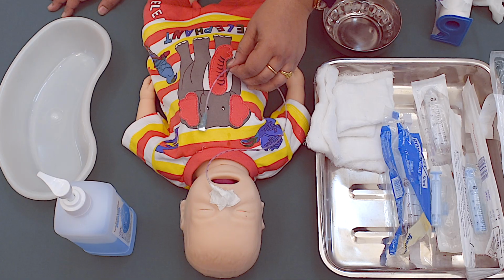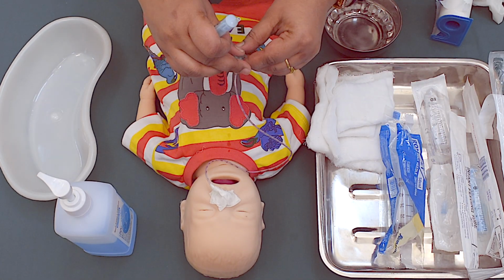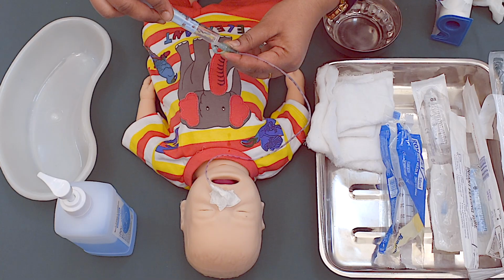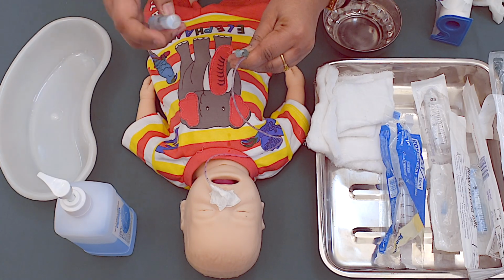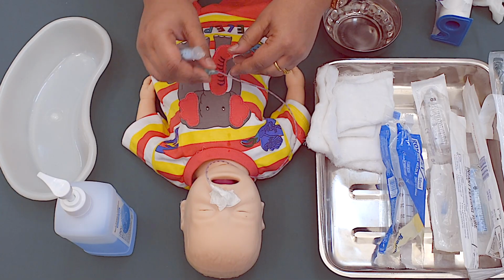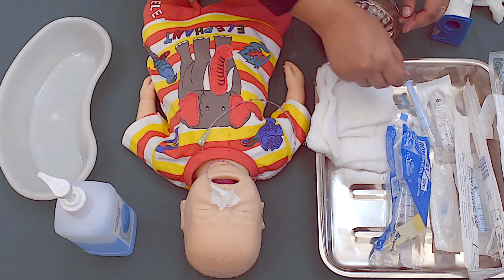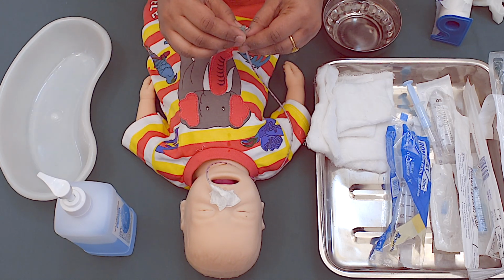Before we begin feeding the baby, check the placement of the tube by aspirating the contents. If we aspirate around 25% of the previous feed, the next feed has to be withheld. Notify the physician in case of abdominal distension or retention of the feed. In case there is no retention, the baby is now ready to be fed.